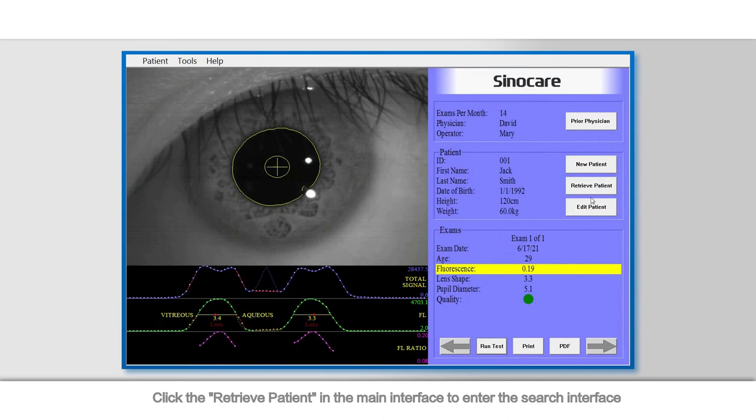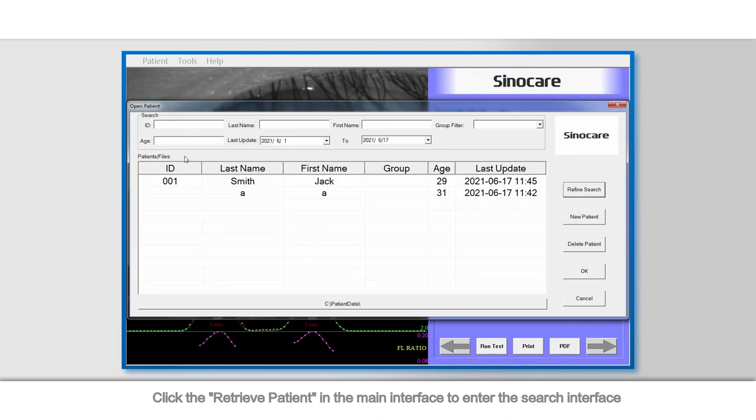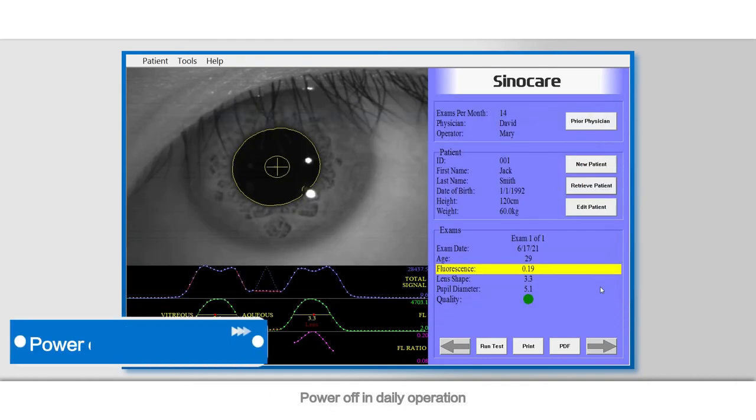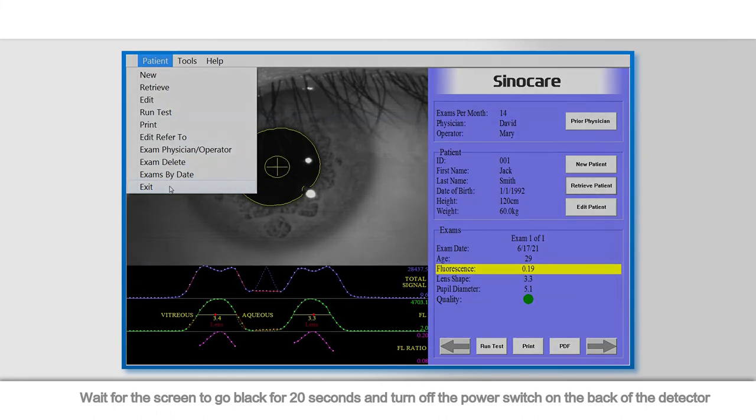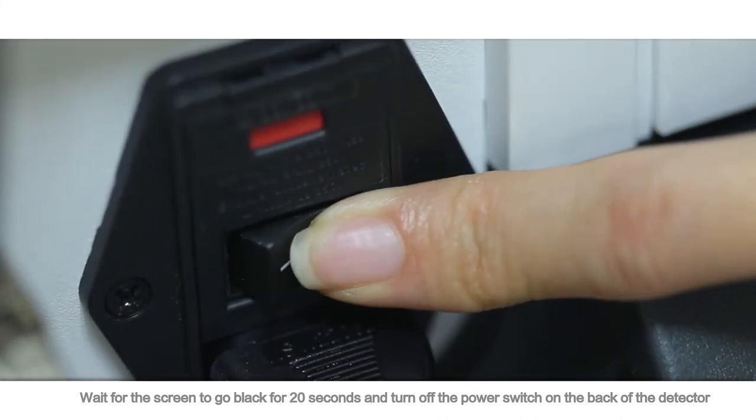Information can be retrieved by keywords such as ID, name, group filter, age, and testing period. Power off in daily operation: click Exit in the patient menu and the detector will power off automatically. Wait for the screen to go black for 20 seconds, then turn off the power switch on the back of the detector.